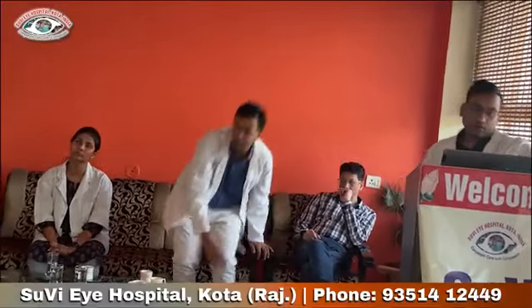They have mentioned temporal PRP one month later to avoid the macular edema induced by the PRP.